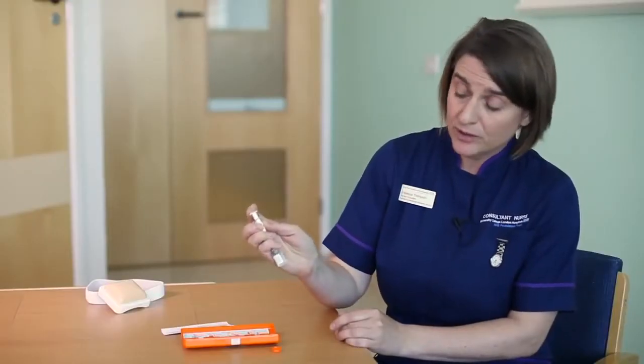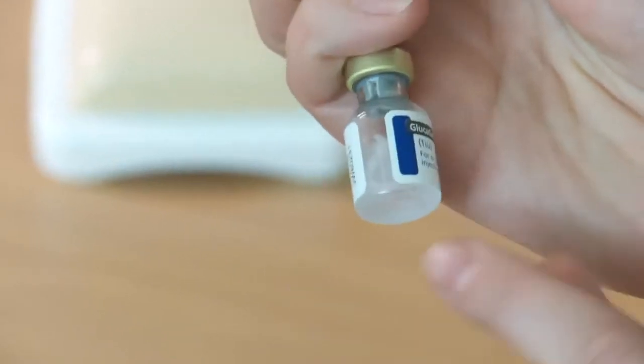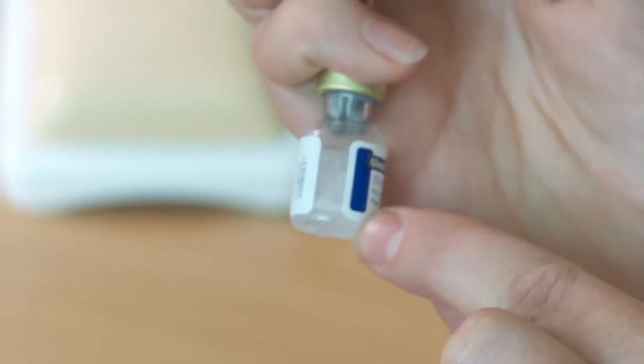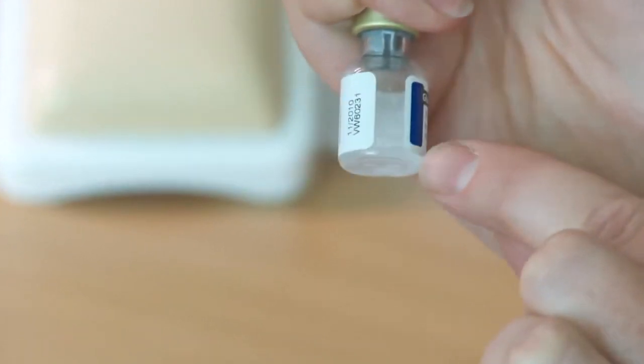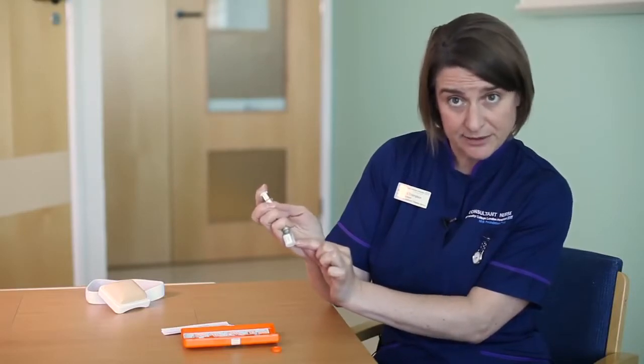Now the temptation is to shake the vial vigorously to try and get the powder to dissolve. That actually makes the situation worse. Try not to. You can gently rotate it if you feel that you need to. What you're looking for is to see that all of the fluid in this vial is clear. It should look like water. Once you can see there's no powder left, it's ready to go.